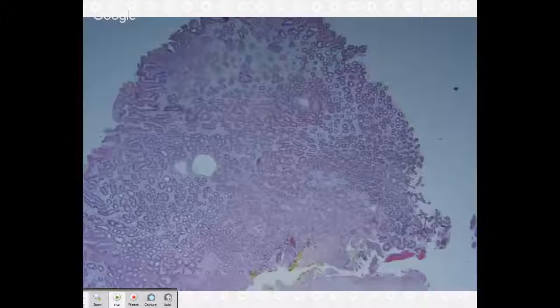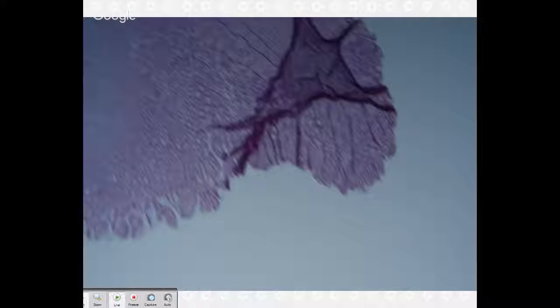So with inflammatory fibroid polyps, the first thing I notice when I even just look at the 1X slide is that it's very pale, right? You look at this and you're like, I have a lesion. It's pretty big and it's very pale on 1X. And when you put it down, this is our 2X view. It's also very, very pale. And that's because it has this loose edematous stroma to it.